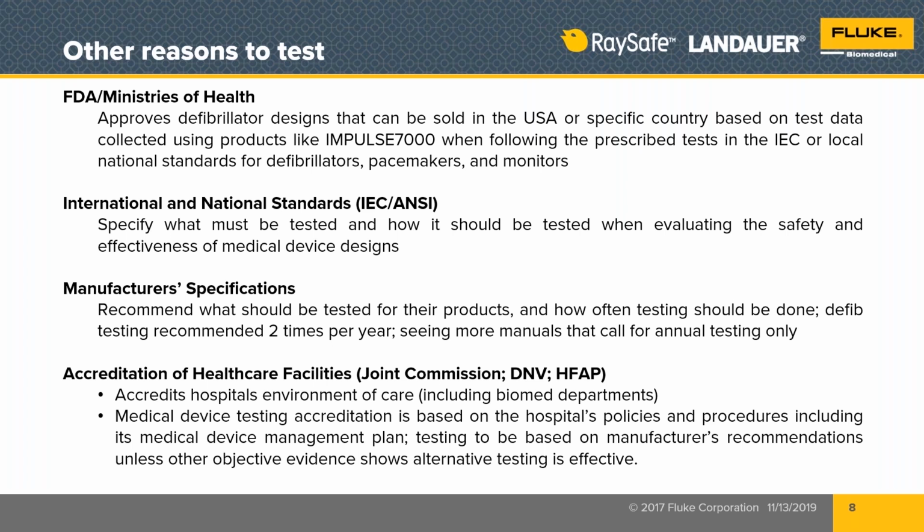Now, they also have accepted for those hospitals that have databased and have analyzed their failure rates to perhaps modify the frequency of inspection a little bit, but not about defibrillators or anything else that falls under the critical medical device category. Now, that certainly includes life support devices, and it includes life-saving devices like defibrillators and more. So if you think in your hospital that you can adjust down and just do once per year or once every 2 years looking at your defibrillator, guess again.